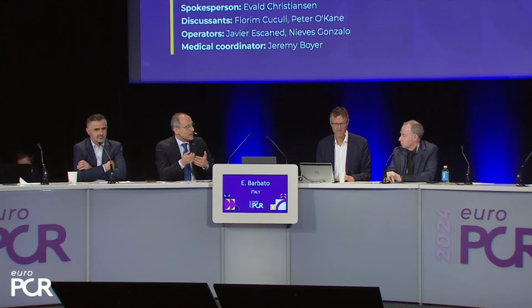Peter, you heard what they shared with us, the colleagues. They want to see imaging. They are actually split between IVUS and OCT. What do you think? One can give more than the other, or they are complementary? Well, it's a great question. I think the key is imaging per se. So once you've decided that imaging is essential, the different modalities do offer different experience.